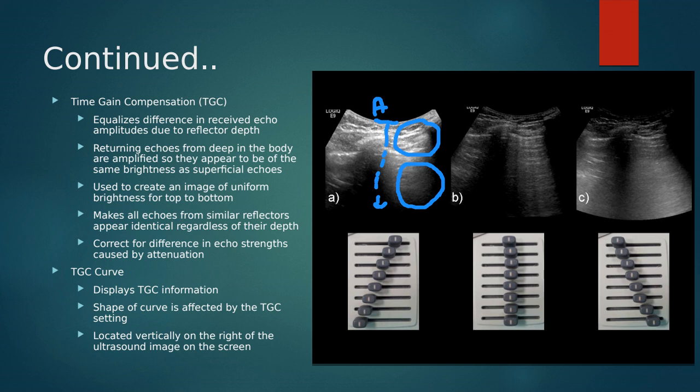So we have to account for that. We want to make sure that our picture is nice and uniform. And yes, we can use gain to help.